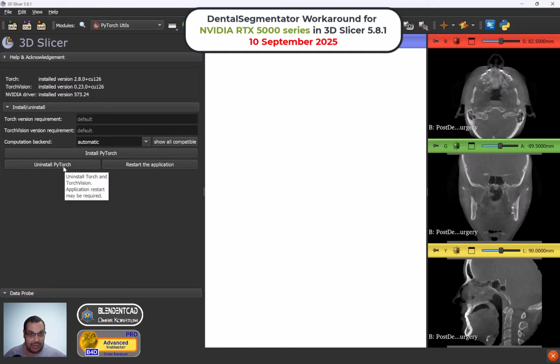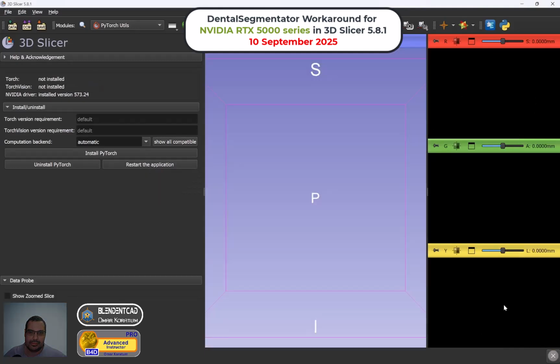Now I'm going to uninstall PyTorch, and then we are going to restart 3D Slicer to finalize the removal of the old PyTorch. So I'm just waiting until the uninstallation is complete, and then I'm going to press on restart application. So the solution for this problem is to force 3D Slicer to install the latest PyTorch version to make it compatible with the latest RTX 5000 series.